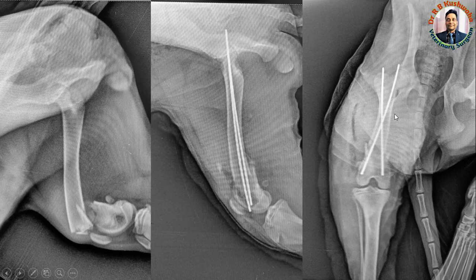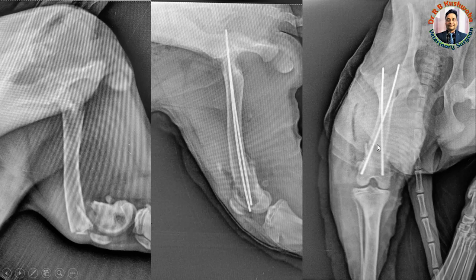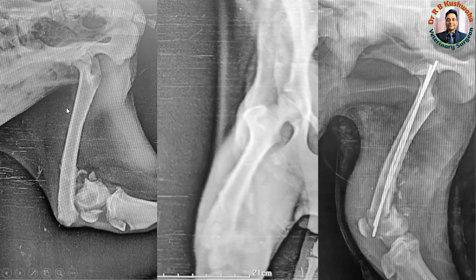The advantage of this dynamic cross pinning technique is that you can remove the pin once the fracture has healed. In contrast, with static cross pinning, where two pins are inserted from the lateral side and two from the medial side, the pins are very difficult to remove and are generally left in place.